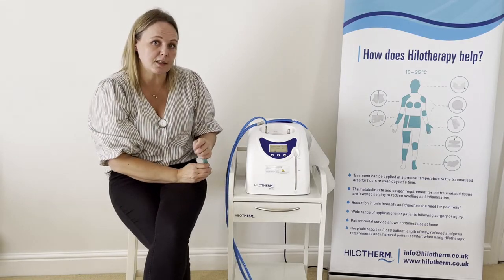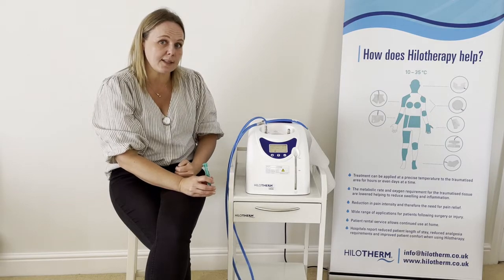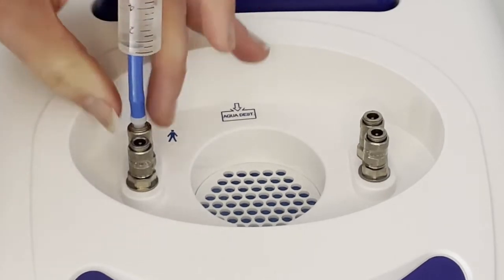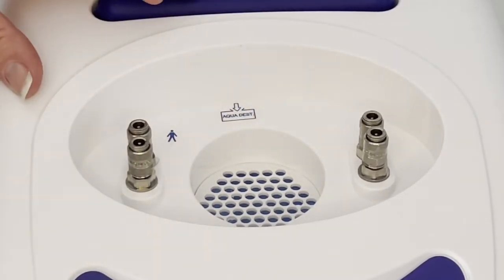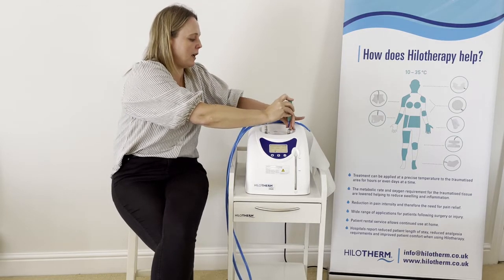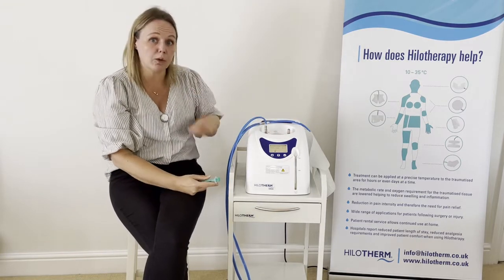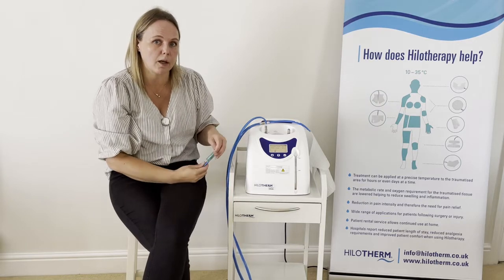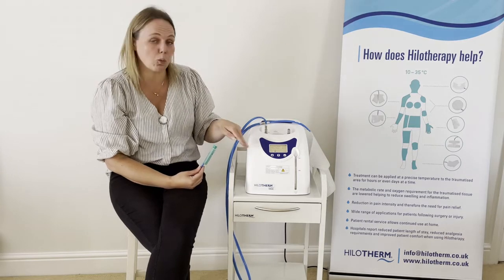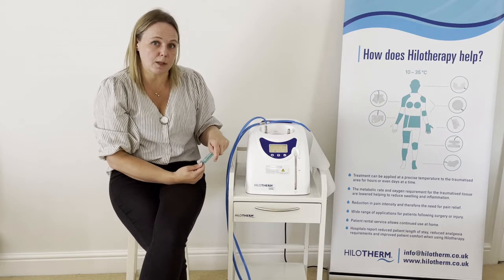Another troubleshooting area: if you press start and the water doesn't start to flow, you may want to check whether there is an airlock in the system. To do that, there is a little de-airing device — click it in and pull up. It's like bleeding a radiator: you are just checking whether there is any air in the system. If there is an airlock, you might need to pull through quite a few times before water starts flowing. You would only need to do this if the water doesn't start flowing when you press start.